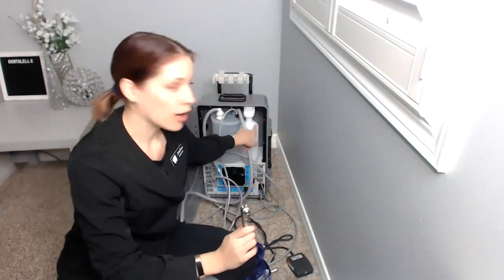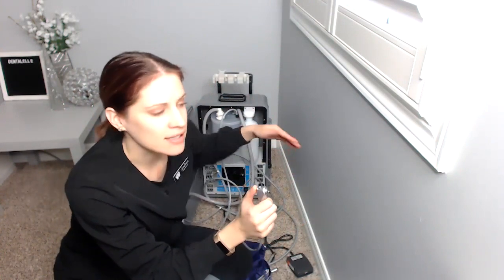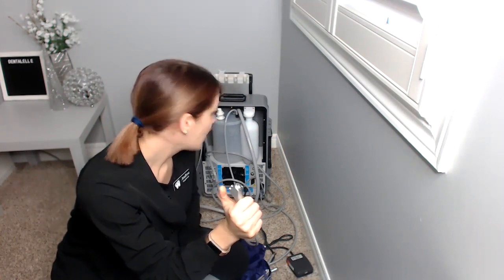So for my water bottle here, they actually say in the manual to run your air for about 10 seconds to decompress it. So that's what I'm doing now. And you should always unplug the unit first. So let me go do that.